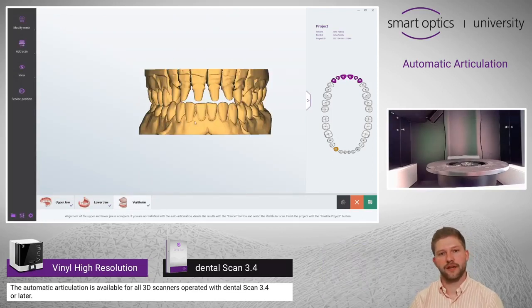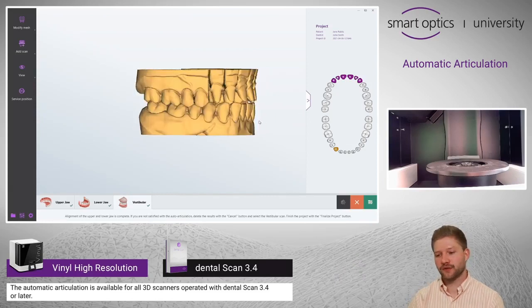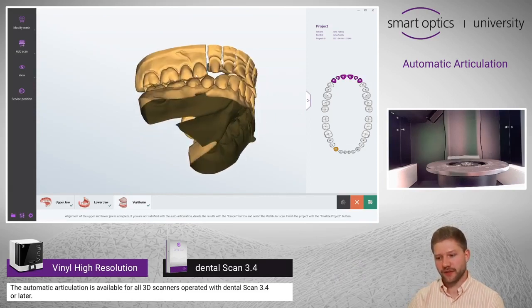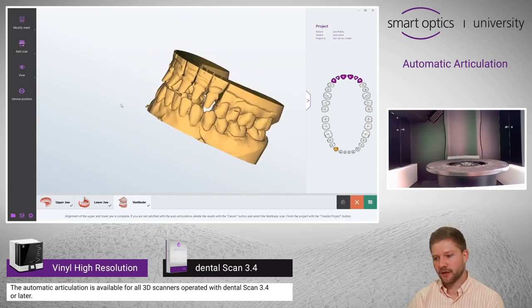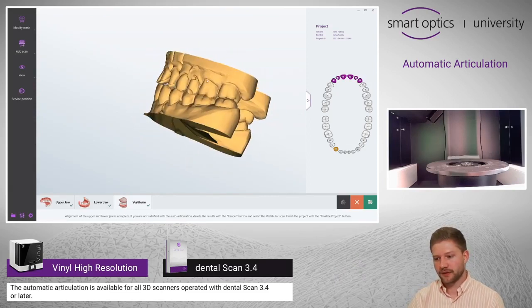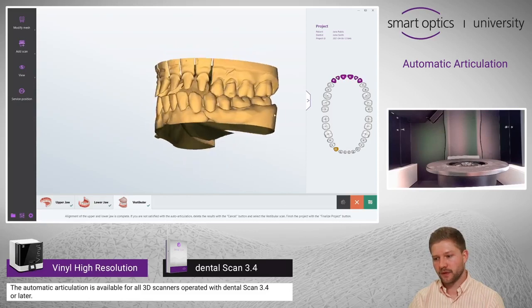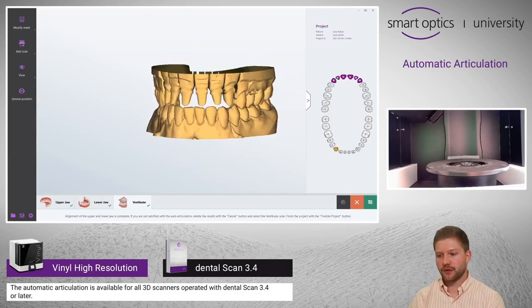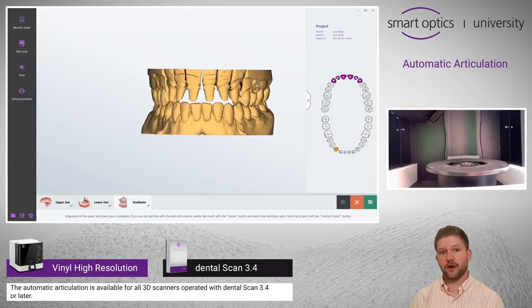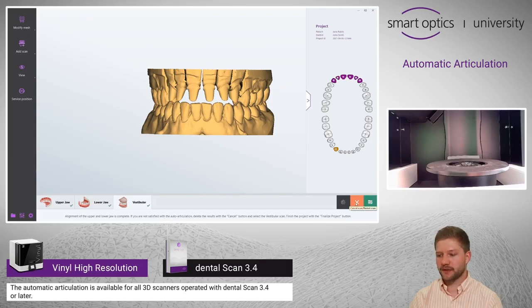The calculation is finished. Now you have to validate the result, and this is looking very good. If you want to repeat the auto articulation, just click on this button.